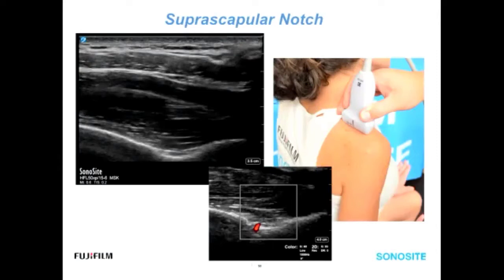And you can do therapeutic injections, or you can do diagnostic injections at this level. So this can be a part of your shoulder diagnosis, while not in a rotator cuff protocol manner, in an ultrasound guided needle injection around this nerve to see if that patient's pain generators go away just by isolating that suprascapular nerve. So this can be a great tool to pull out of your toolbox if you've run out of other options.